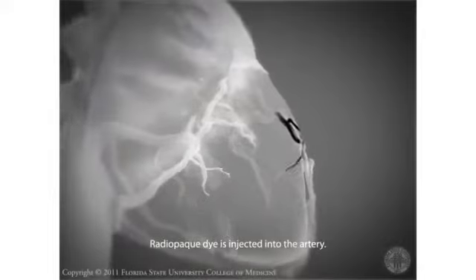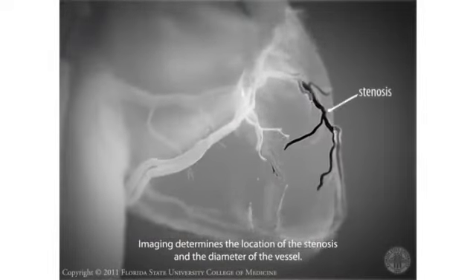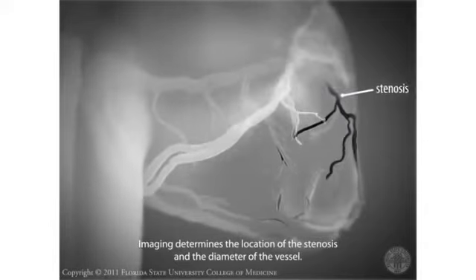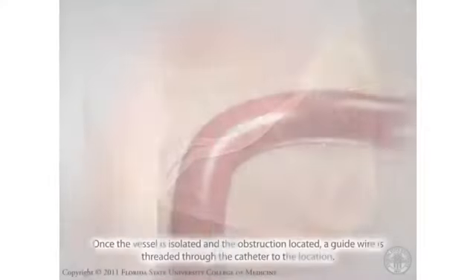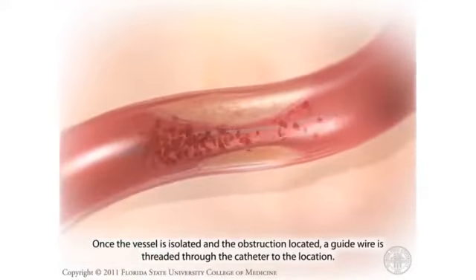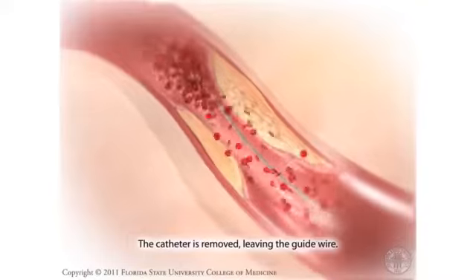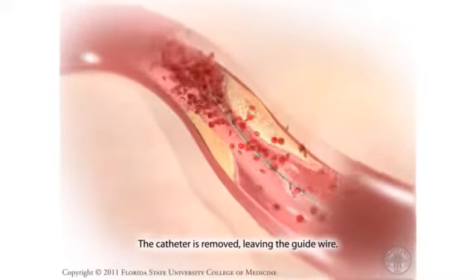Radiopaque dye is injected into the artery. Imaging determines the location of the stenosis and the diameter of the vessel. Once the vessel is isolated and the obstruction located, a guide wire is threaded through the catheter to the location. The catheter is removed, leaving the guide wire.